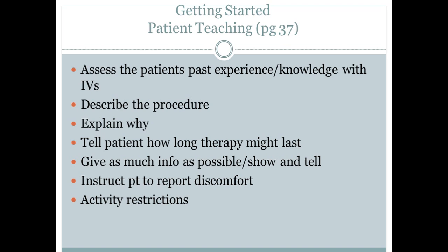I'm also going to talk to the patient about activity restrictions and to be careful. There's a lot of different things that you can do in the hospital setting that'll help with that IV tubing. I always called it a neti. I'm not sure exactly what the term is for, but I've seen them used sometimes in holding up an arm. They come in a box, and it literally looks kind of like fishnet stockings, but it's like a cotton. I'd use those for the kids to put over for that J-loop or any tubing that might get pulled or dislodged, and that would help hold that down.